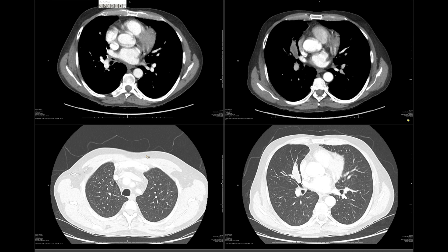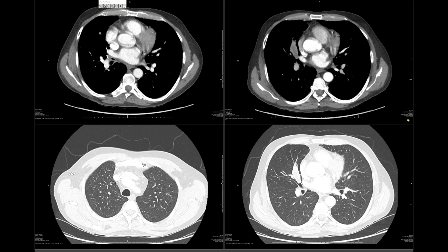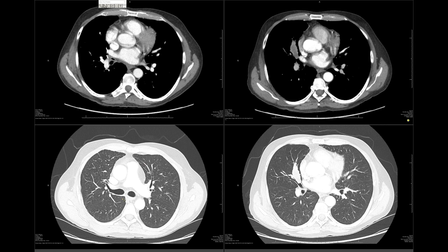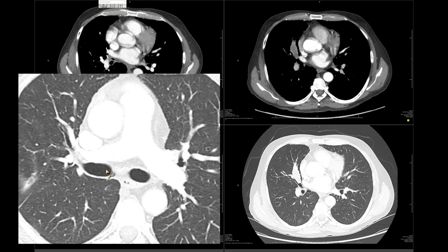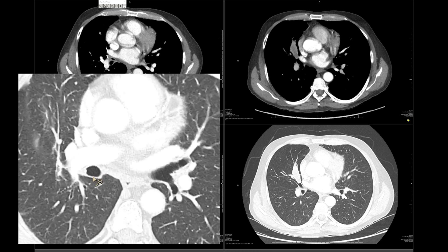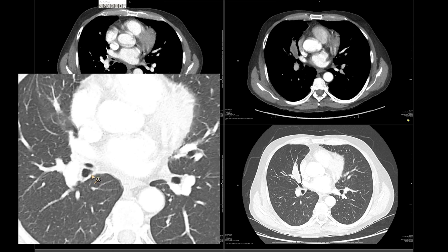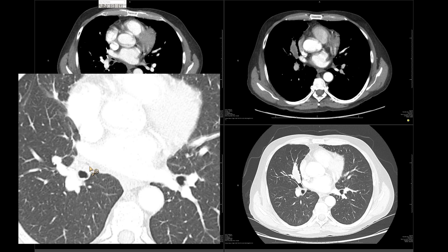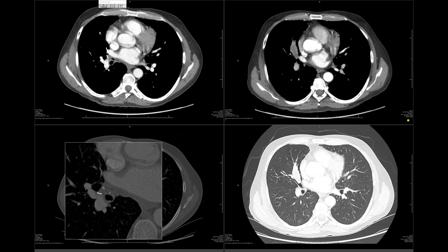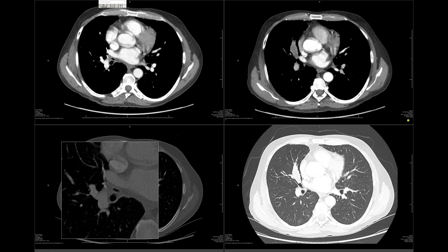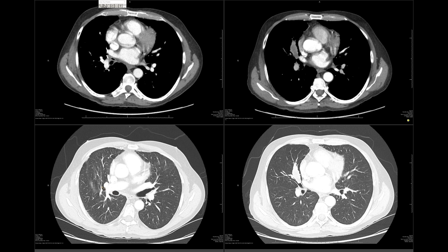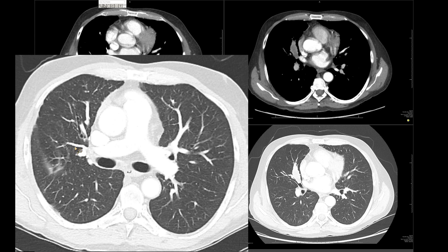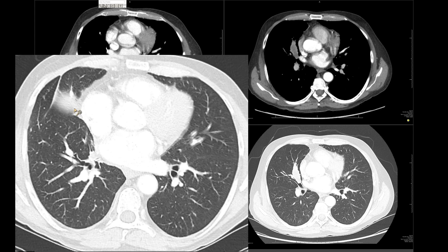Let's move on to the middle lobe. Here's a patient who's had a right middle lobectomy. We're going to follow the airways down and see what's missing. At the carina we have the right and left main bronchi; the first bronchus to come off is the right upper lobe. As we continue down, the bronchus intermedius divides into an anterior bronchus and a posterior bronchus. If we follow the anterior bronchus, you can see that it just stops. On bone windows, there's a clip line just distal to the bronchial stump — this is a right middle lobectomy. Staple lines are visible in the remaining margins of the lobes because of the incomplete fissures.